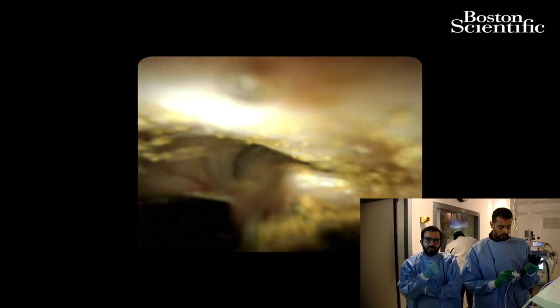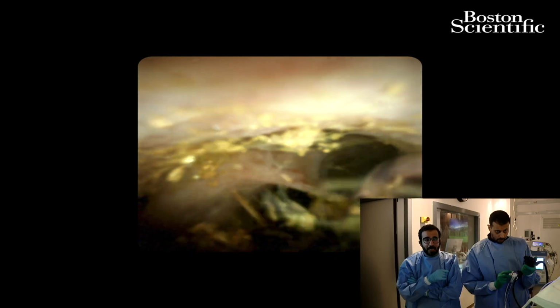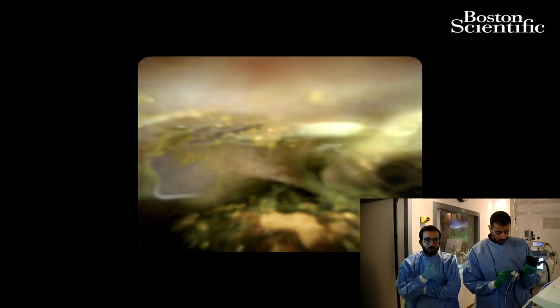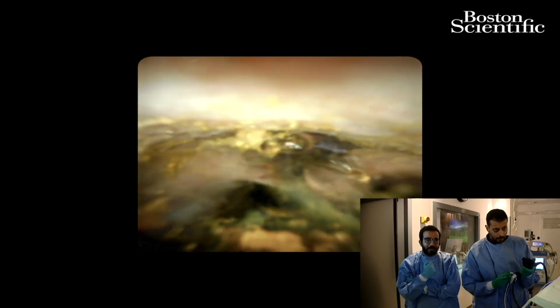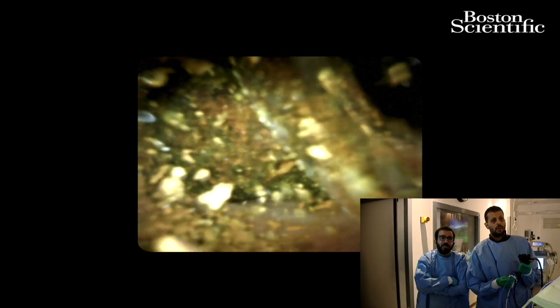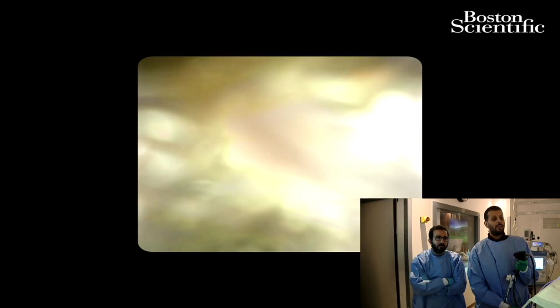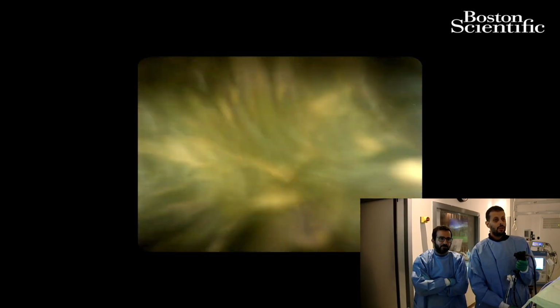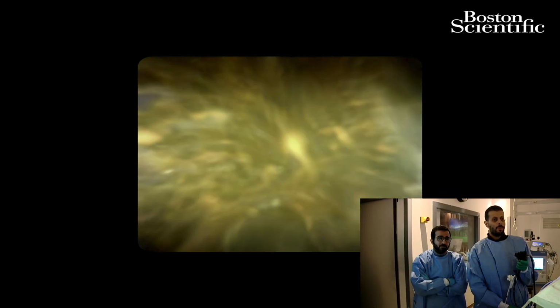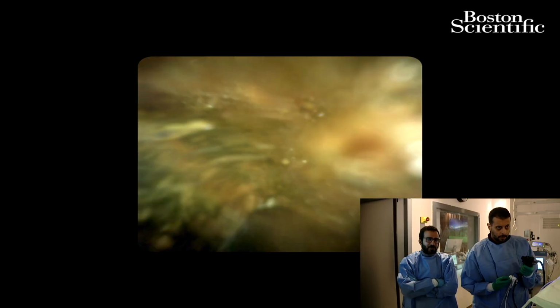Now we are just coming out with the cholangioscope. We fragmented all the stones, so we will come out with the cholangioscope and put a wire with the stone extractor balloon just to do a sweep. So there's another one here. We just crushed it. That's the importance of withdrawal. Careful withdrawal. There are too many suspects here in the bile duct. But I think this is okay. It's not that big. Yeah, it's already crushed with this one.